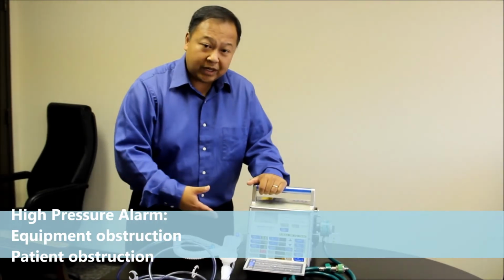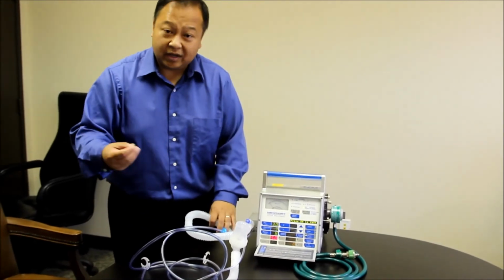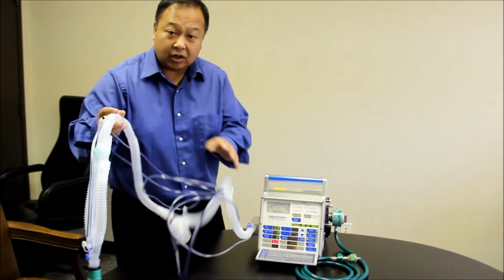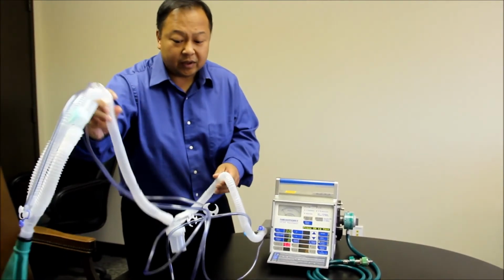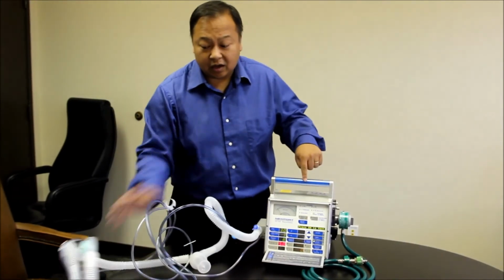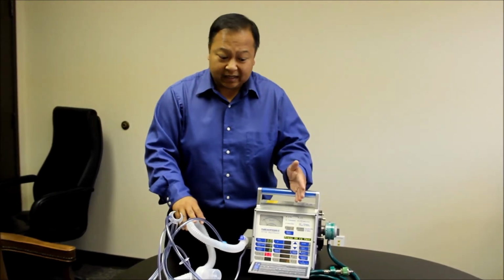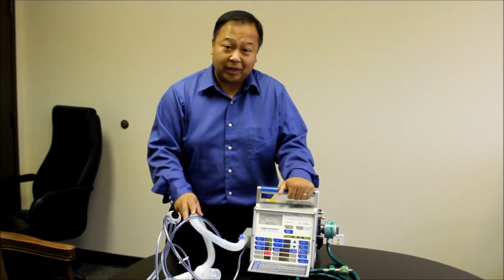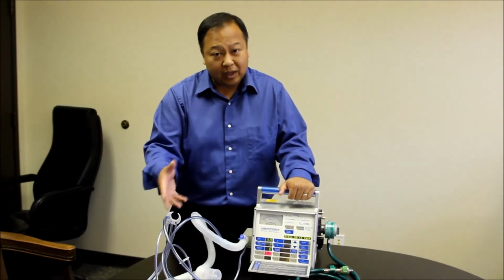Water: when your patients are in the unit, most of the time they're on humidified air, so you'll see a lot of condensation along your tubing, and if a lot of water builds up in the tubing, you'll also get high pressure alarms. So instead of hitting the silence button, find out what's causing it, fix that, and then the ventilator won't alarm anymore. Most important thing: look at your patient first, and then figure out how to fix it.